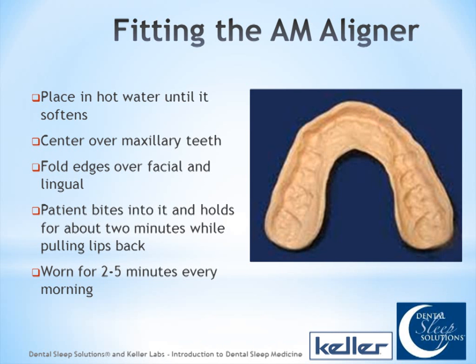Well, you're going to tell them that when they get up in the morning after some time, this thing's not always going to feel that way. You may feel like your front teeth are hitting too hard, and you want to put this thing in and bite down on it and clench your teeth. I even personally wear a dental appliance myself every night. I take my hand and push on my chin and really get my jaw to seat back, and I wear this thing around in the morning for 5 or 10 minutes until my back teeth start feeling like they hit normally. And I think if we do that, it's really going to help a lot of the bite changes I've found in my practice. Any other thing I missed on that, Rich, that you can think of?